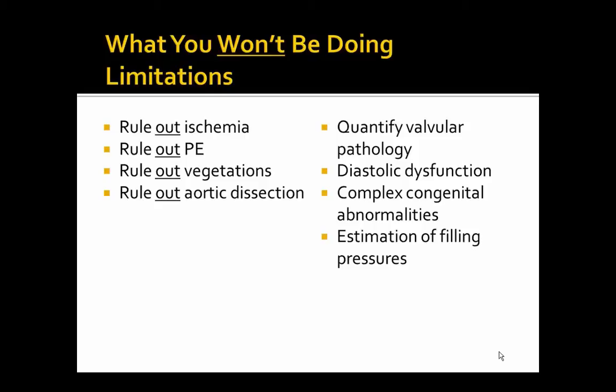So if you go at a patient with the question of, are they having a heart attack or not, and you try to figure that out with a bedside echo, you are not going to exclude that diagnosis.